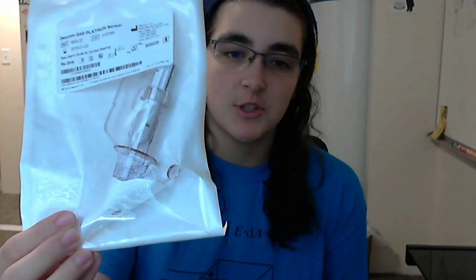Hello, I am going to go over how to put in a CGM today. A continuous glucose monitoring system is basically composed of 3 different parts. And so we have the actual sensor, which I will be showing how to insert today. And then attached to that will be this little transmitter, this little contacts to the sensor. And finally the receiver, which will actually display the readings for all the blood sugars every 5 minutes.